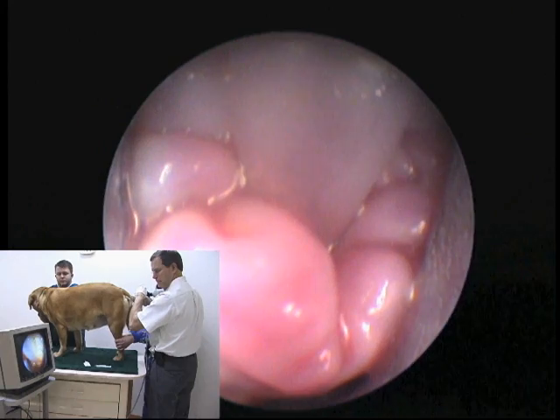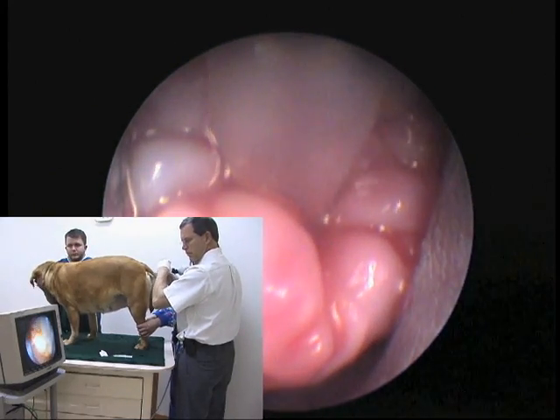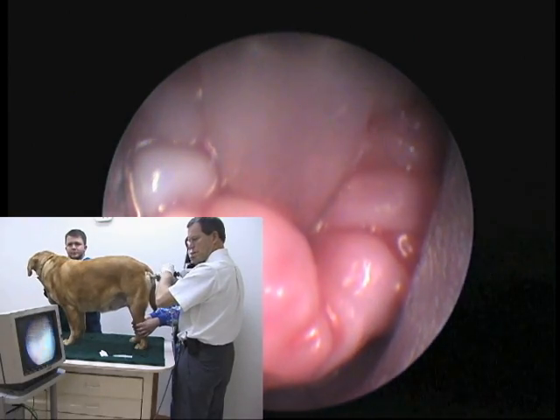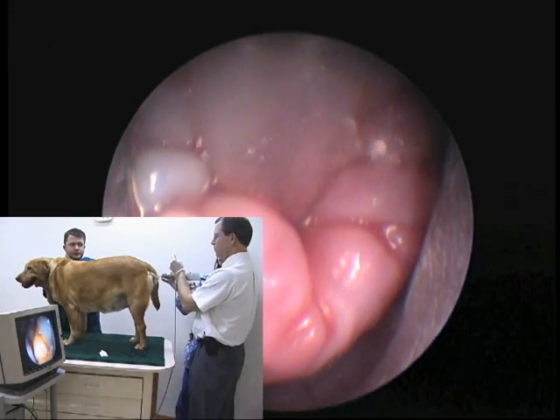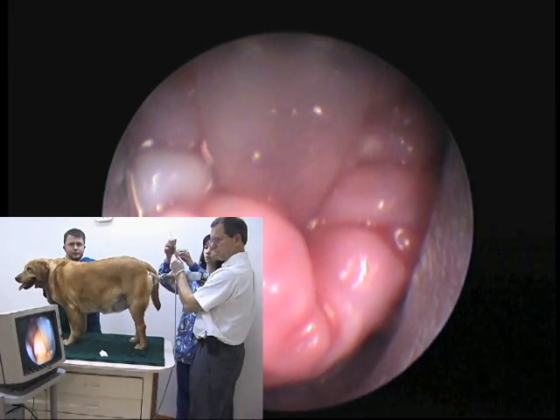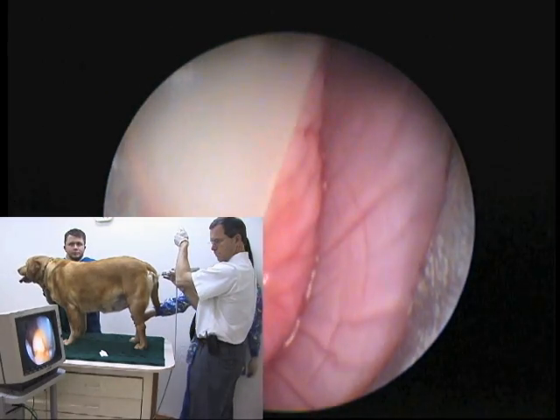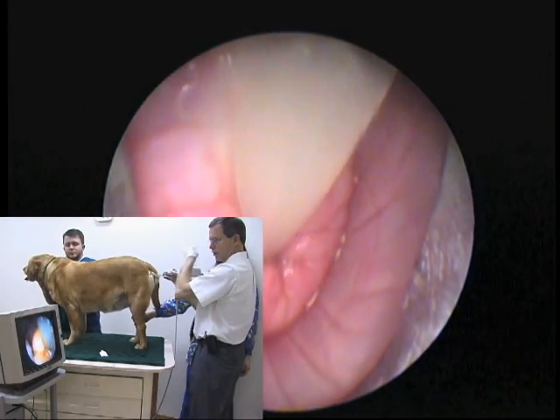The sovereign catheters have two openings in them and we put the first opening in. As the first opening is in, we attach the syringe and then watch the air bubble out of the top opening that is just at the cervical os right now. The video is a little bit behind, but you can see the syringe being attached at that point. Once the column of semen is at the cervix, we advance the catheter into the cervix and continue the breeding.